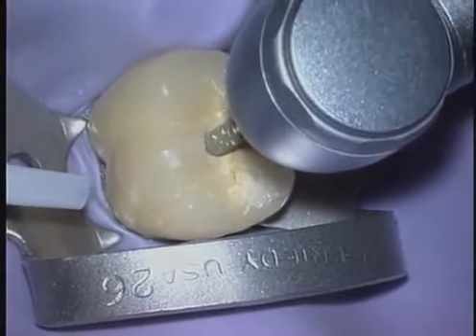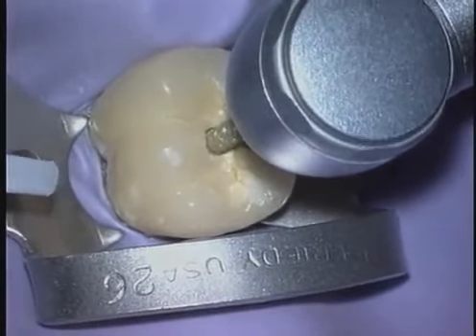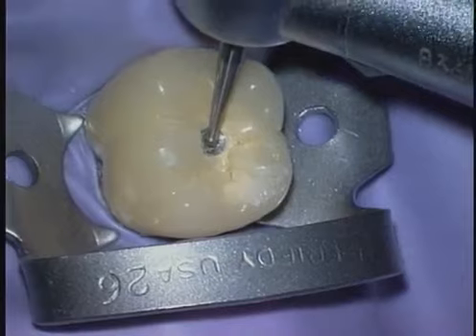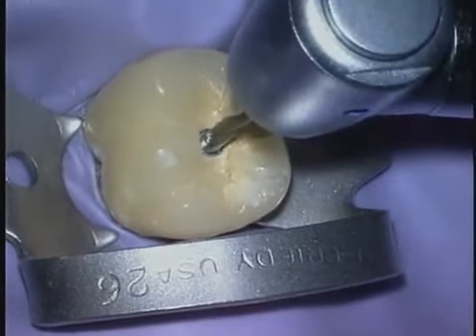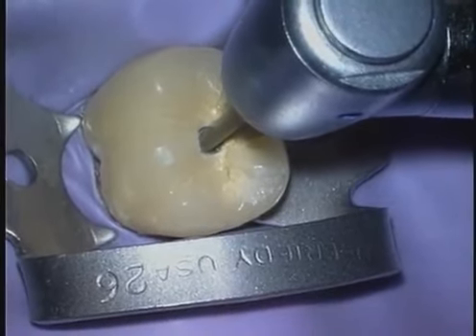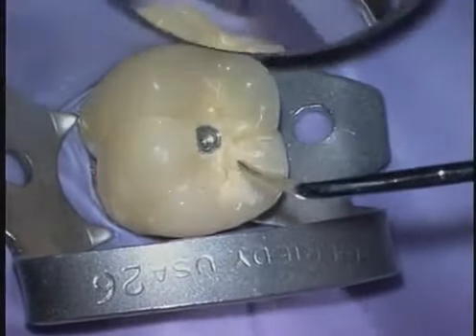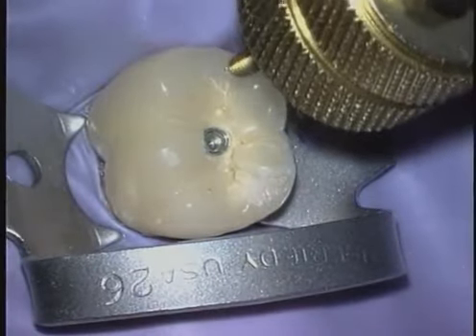The diamond burr is used to penetrate the porcelain layer until the underlying metal is observed. Next, the small carbide round burr is used with a light touch to penetrate the underlying metal. The parallel wall drill is then selected to machine a precise opening to specifically match the metal lift removal instrument. With the drill removed, we can see that we have created a precise channel.